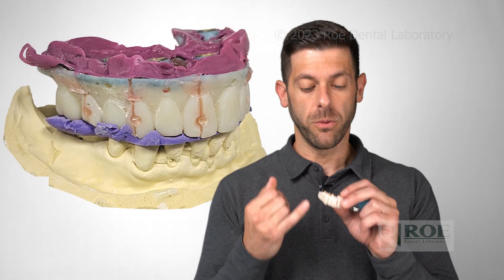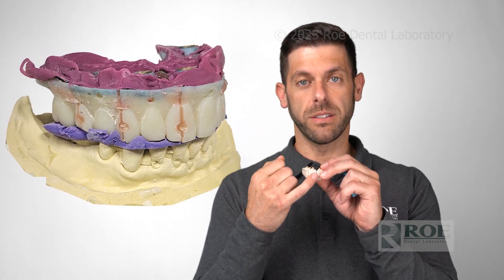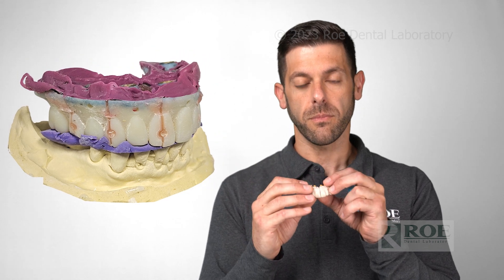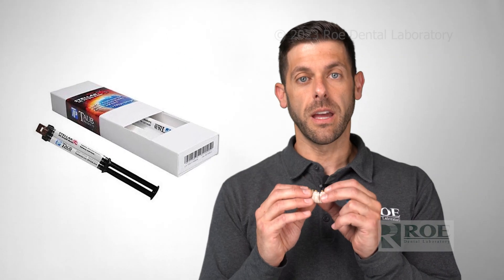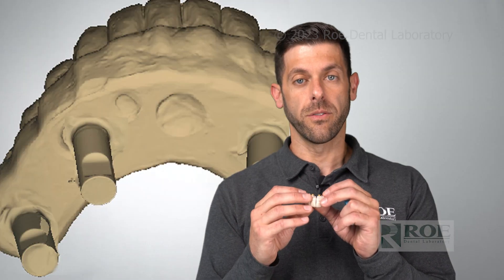The next step is we want to lute each one of these sections together. You can use a few different materials for this. One of our favorites is Stellar — it's a dual-cure resin. Make sure it's luted together.